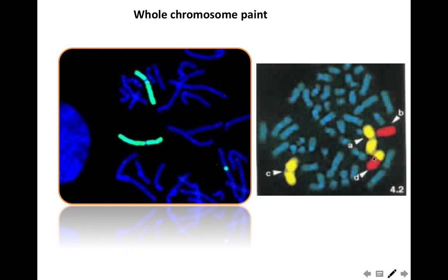But there is a translocation present here. There is a translocation in this chromosome, and you can easily say if this is a balanced or unbalanced translocation. So what do you think? Is it balanced or unbalanced? Well, there is an extra part of yellow here, so this means that it is an unbalanced chromosomal abnormality.